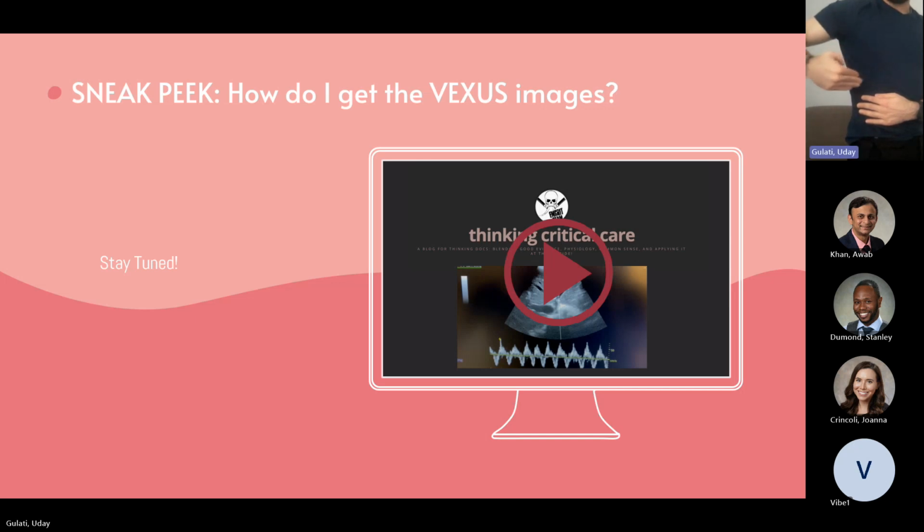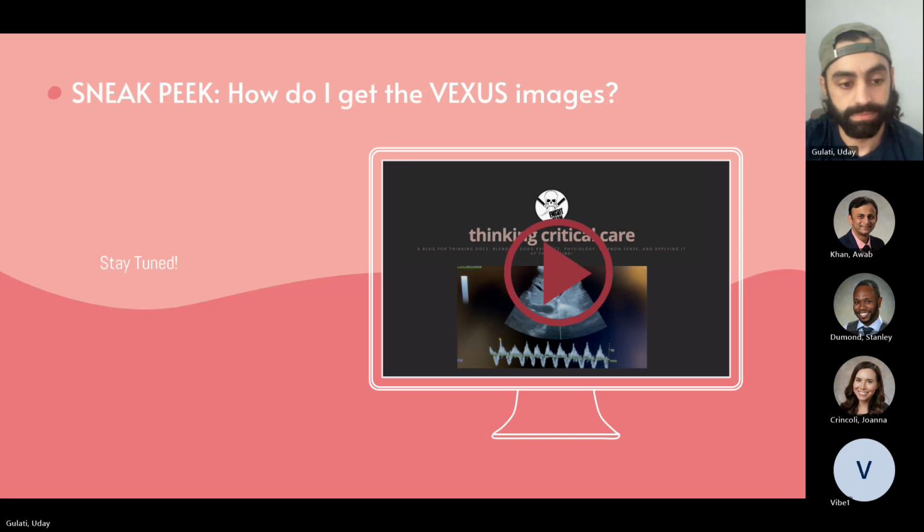And so if your IVC is in this view, and you see your hepatic vein as well, fan your probe up towards the top of the abdomen, and you'll start to see your portal vein. Other markers of what a portal vein should generally look like from that view: it usually has a very thick border to it. It's usually a lot skinnier, and a confirmation could be color Doppler.